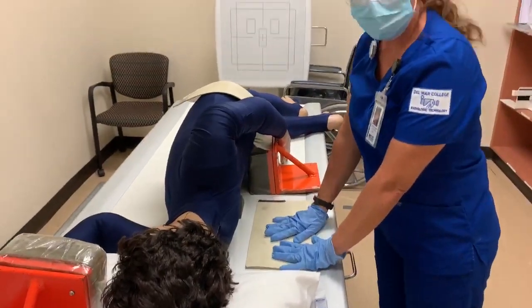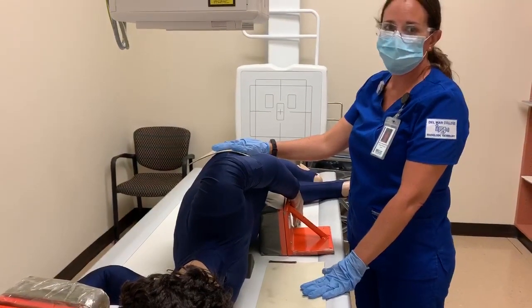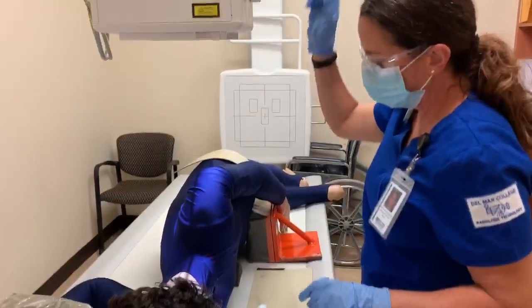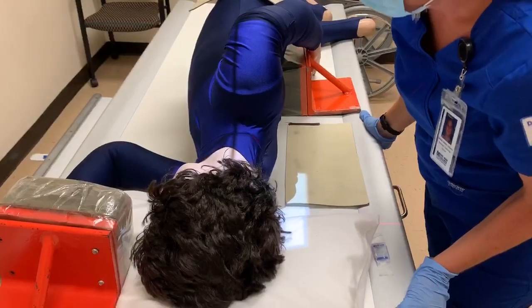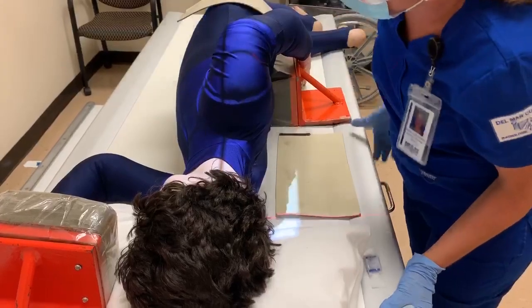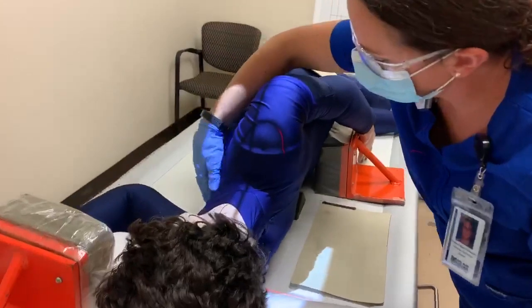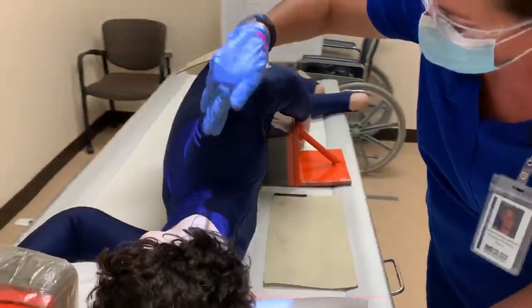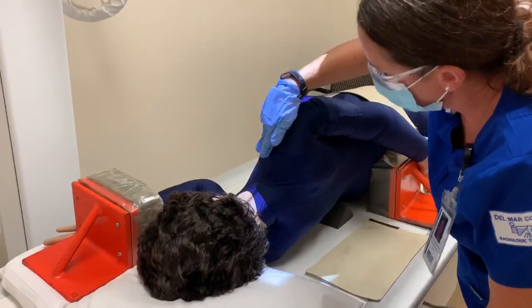You want to leave the mat to clean up the scatter. You want to leave the shield to make sure to protect your patient. And my CR is going to be at T1. And for the swimmers, you just kind of want to skim the shoulder right here. So the CR is at T1, which is 1 inch above the jugular notch. But like I said, if you just kind of make sure that you skim the shoulder, you need to move up just a little bit. You skim the shoulder right here.